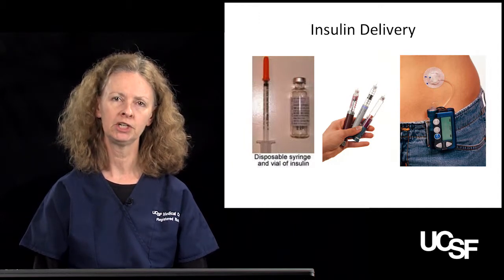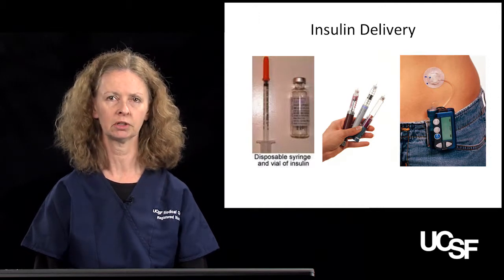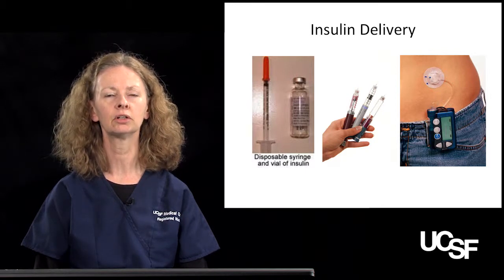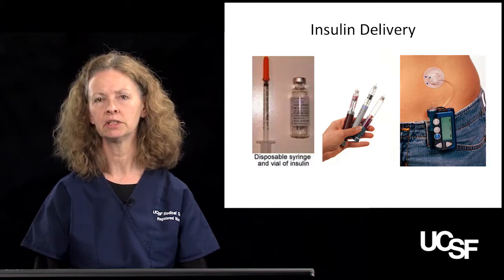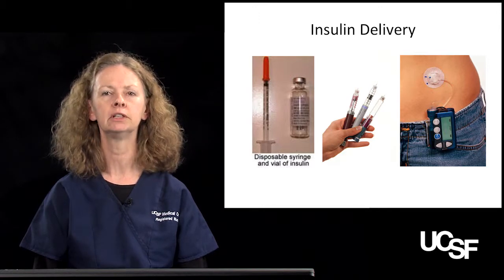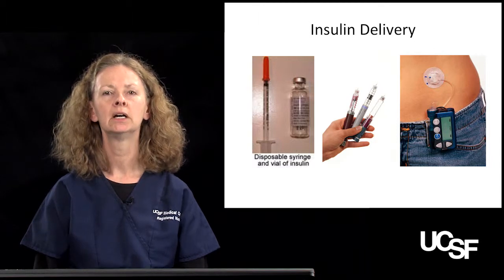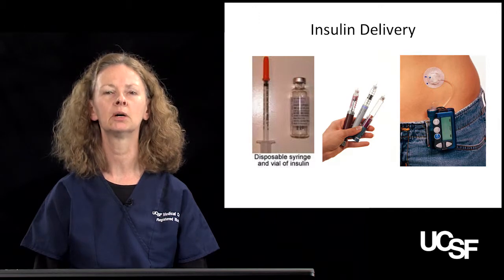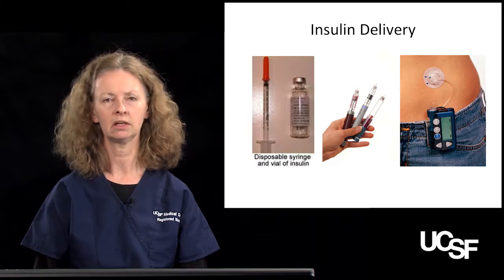It is important to let patients know that it is okay to keep their insulin at room temperature. If they have extra insulin, certainly store that in the refrigerator, but the insulin that they are currently using is okay at room temperature. Many times patients will leave their insulin at home rather than bringing it with them to a restaurant because they're afraid of having it out of the refrigerator, and that can cause them to miss doses. I am going to show you a couple of the different pens on the market in a couple of minutes, and I'll show you how someone would give an injection using that insulin pen.